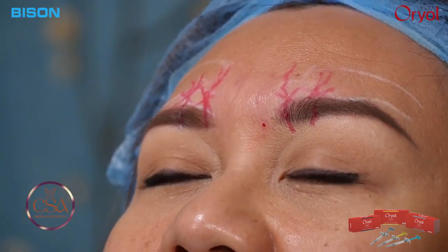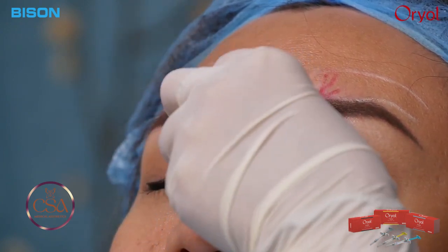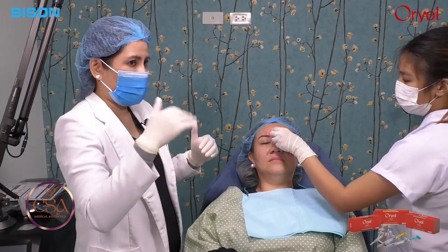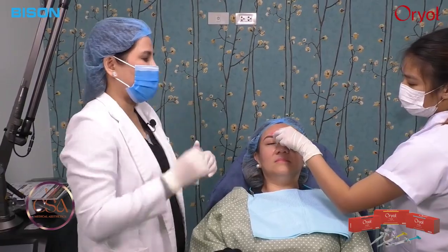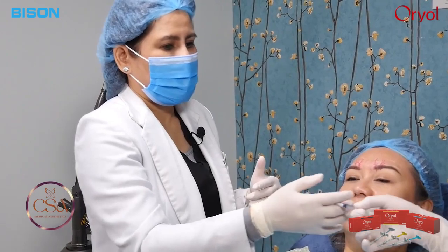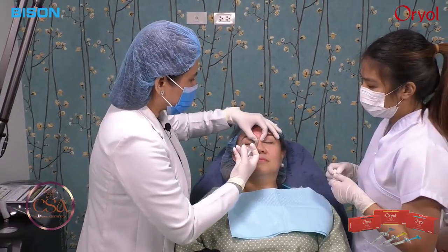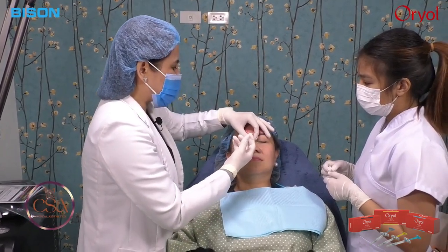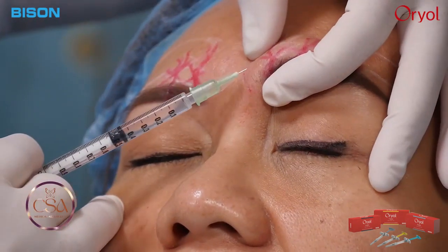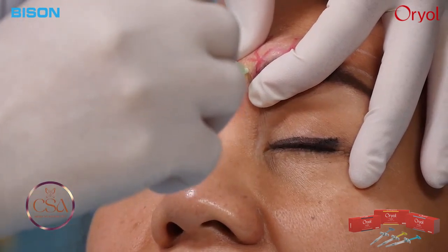Now the filler attracts water 10,000 times, so we still give time for the filler to expand. It will further stretch the skin, it will further elevate that indentation or depression, and it will improve the skin integrity as well. And my final touch will be the toxin injection. So I have here my neurotoxin. I'll be injecting the procerus muscle here, okay. Intramuscular injection, you can start with 2 units here, and then the belly of the left corrugator. So you can also give your 2 units there.